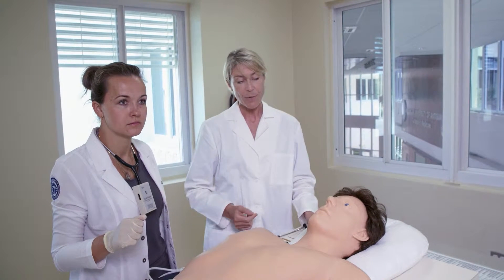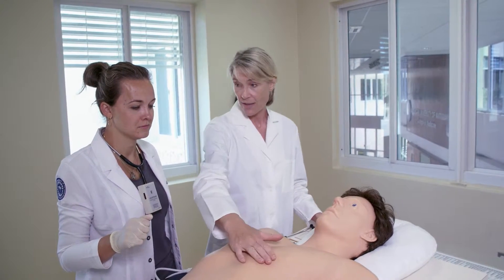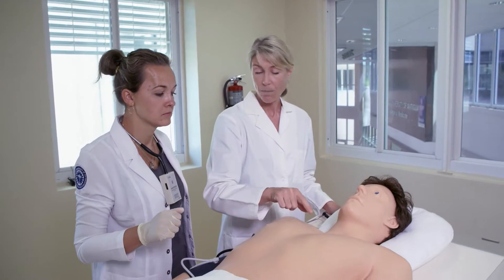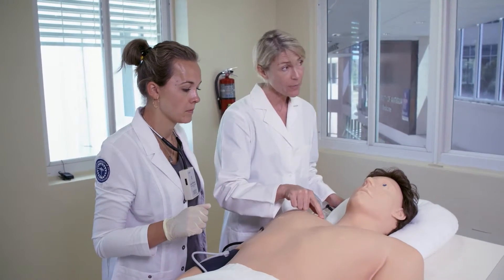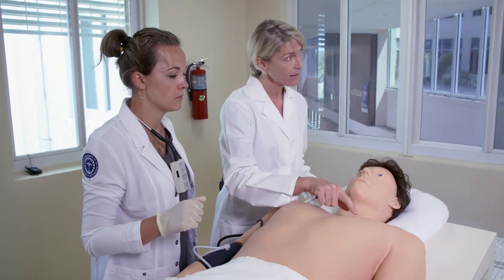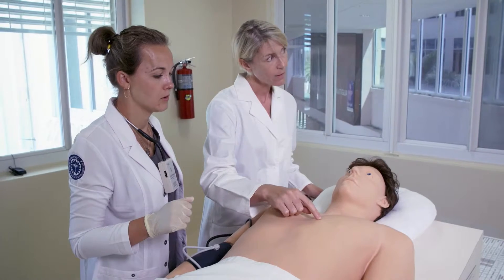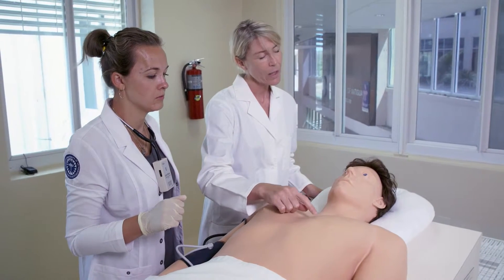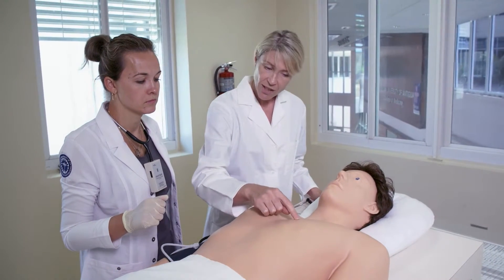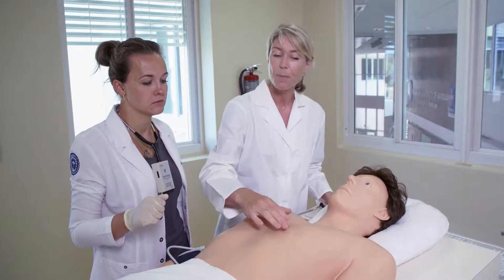So now let's review the areas of auscultation again, because this will come in handy. We've got — which area was this one? Aortic. And tricuspid, which is the third and fourth left sternal edge.